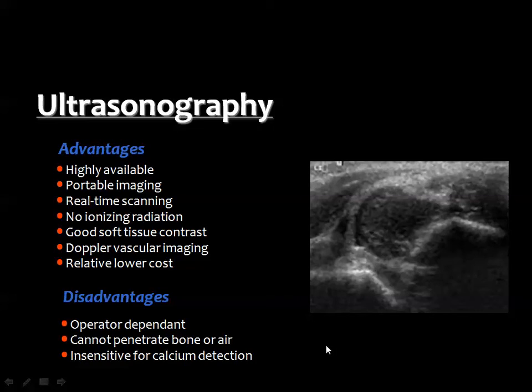And the major disadvantage of ultrasound is that this technique is operator dependent. If you have an expert sonographer, you will get good results and good diagnostic imaging information. But of course, in Egypt, we have a limited number of radiologists who can master musculoskeletal ultrasound. Then ultrasound cannot penetrate bone or air, and this is one of the drawbacks, and it is also insensitive for the detection of calcium.